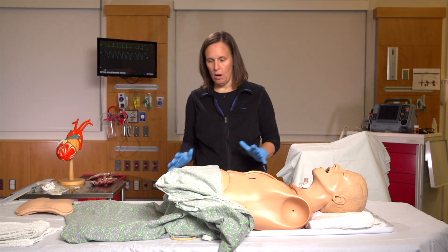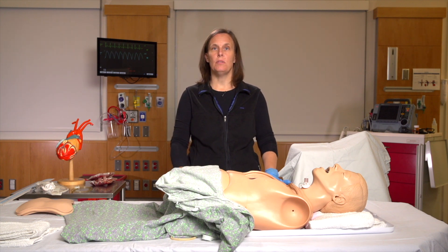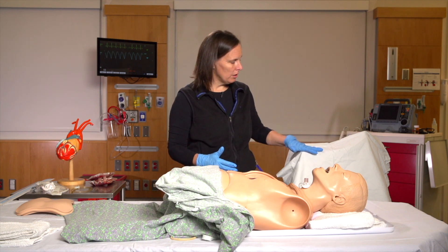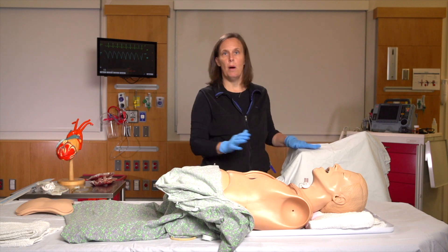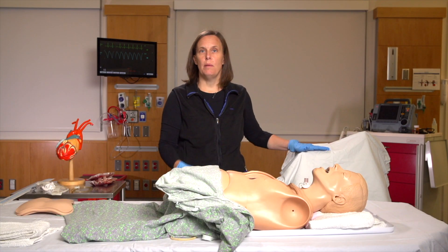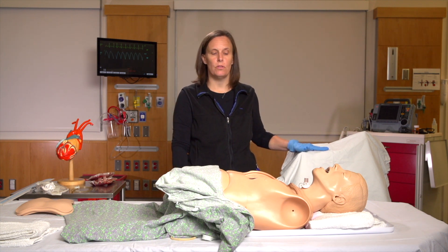During the case we had a bedside nurse simulated participant and a patient family member. The nurse stood at the pump device and was able to turn the pump on and off during the case when cued by the simulation operator by a series of coughs. The patient family member was also able to provide additional history to the learners, because the patient with the trache is not able to talk and give that important history during the case. Those two roles are very important.